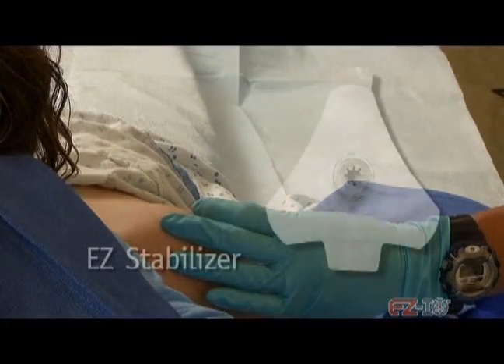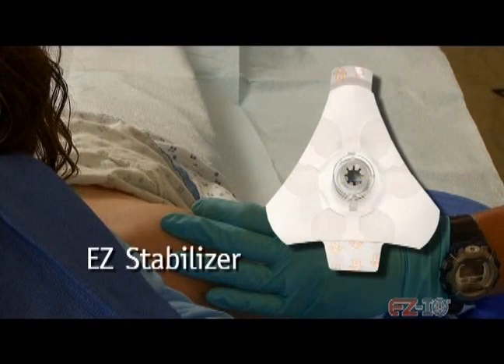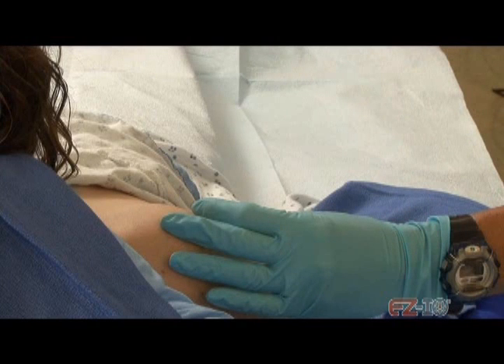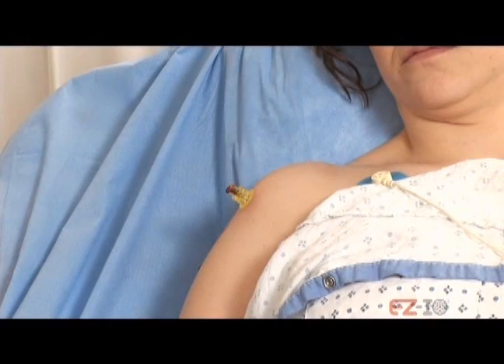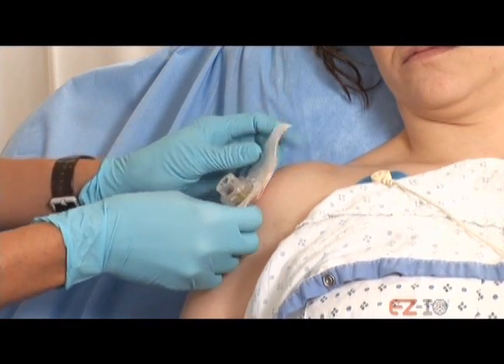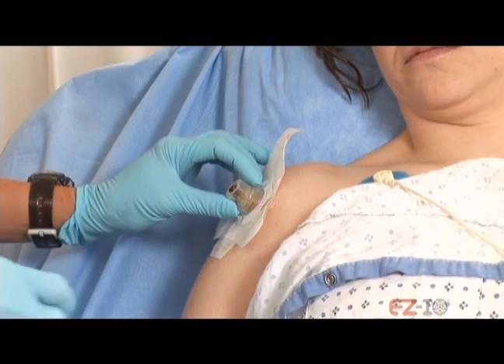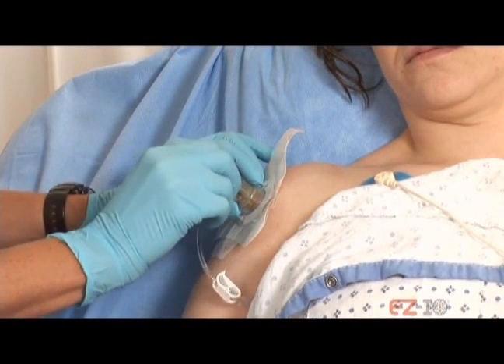We recommend you use the Easy Stabilizer when accessing the proximal humerus and when placing the Easy IO in pediatric patients. In the next scene, we will demonstrate the placement of the Easy Stabilizer. But for the remainder of this video, we will show the catheter in place without a stabilizer for visual clarity. After removal of the stylet, place the stabilizer over the IO catheter hub. Attach the Easy Connect to the catheter hub.